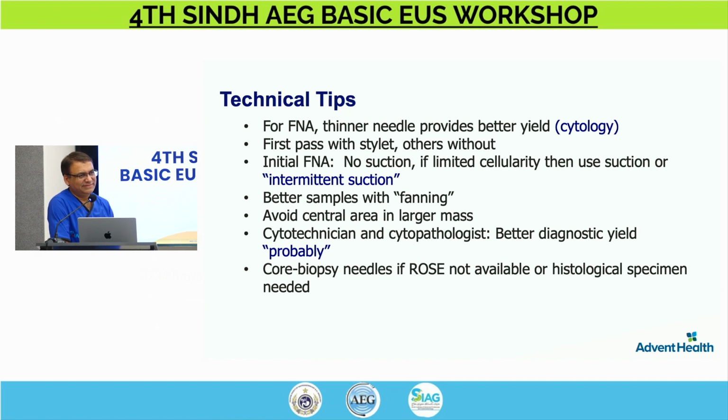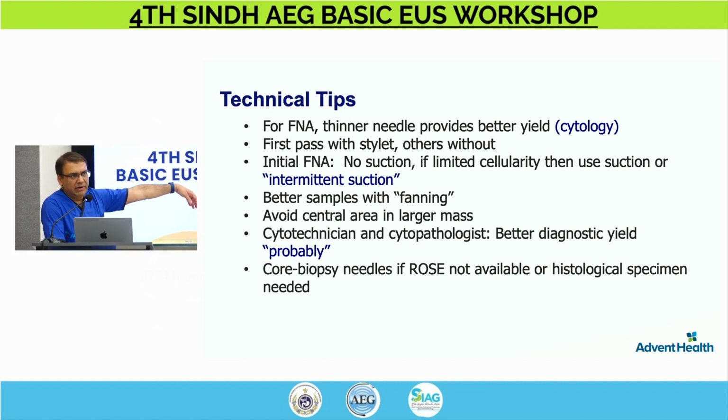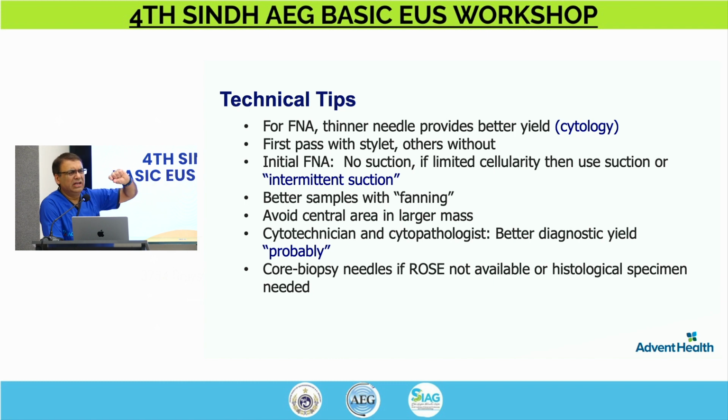So technical tips, I think I kind of said that all, but if you are looking for cytology only, I mentioned about small lesions, bile duct wall. In those cases, maybe just use a FNA needle. Needle comes with the stylet, so I don't take it out with the first pass. I will take it out. I don't use it for the next pass.